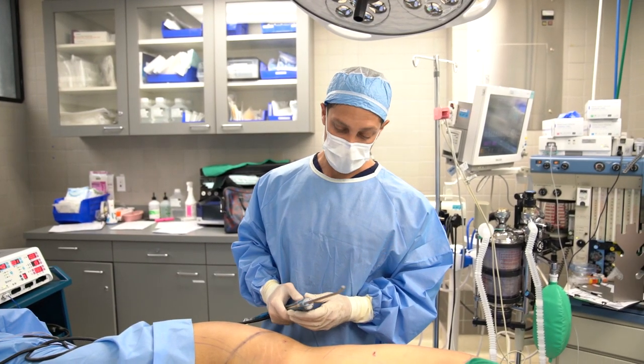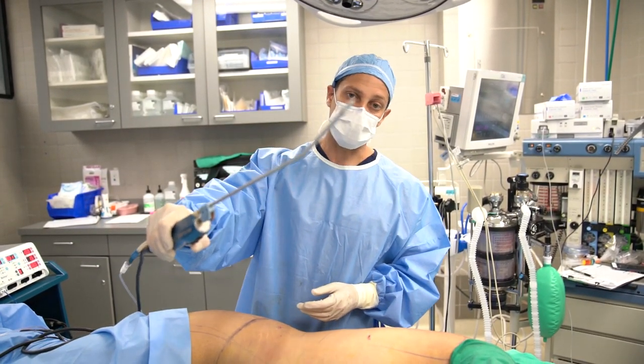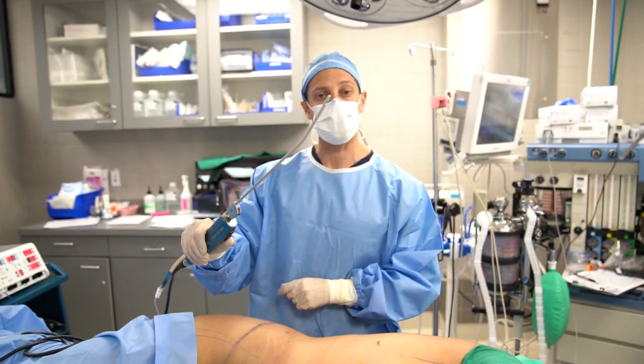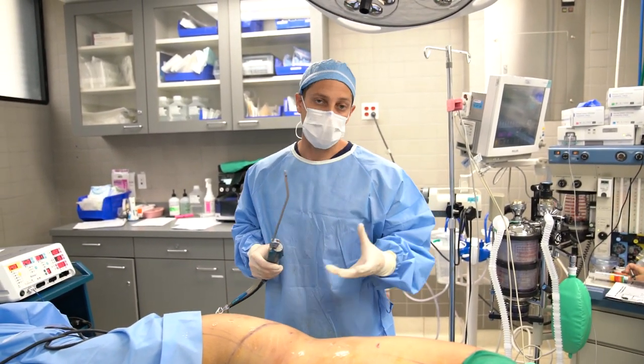There are four steps to liposuction. The first step is SST — Simultaneous Separation Tumescent. That means we go in with this device which oscillates, moves back and forth, and we also add fluid — tumescent fluid — that gets the fat tissue ready to be harvested or removed.